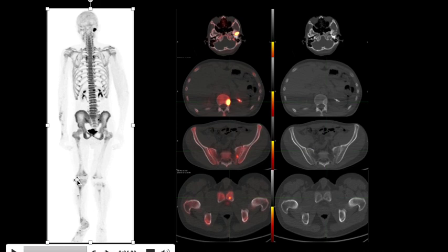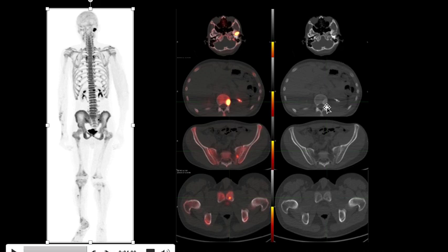This patient's primary was in the right proximal fibula. It was an osteosarcoma that was resected and now they have multiple bone mets which are seen here on the images. There is involvement of the left mandibular head, left side of the L1 vertebral body, a focus in the left sacrum and a focus in the left pubis. All of these foci of increased uptake correspond to sclerosis seen on the CT in the bone window. This patient has sclerotic bone mets that are lighting up on sodium fluoride PET CT scan.